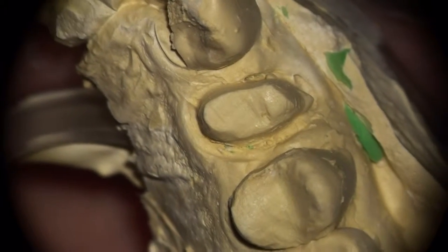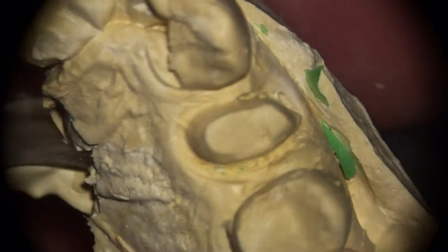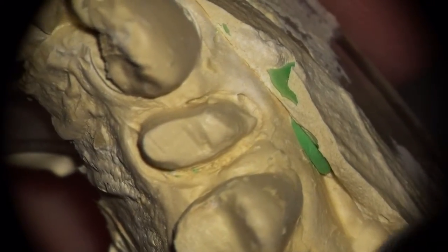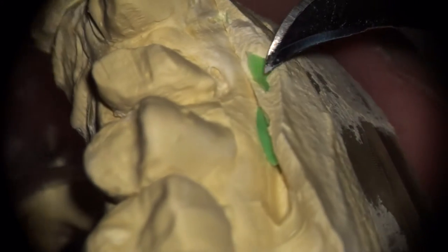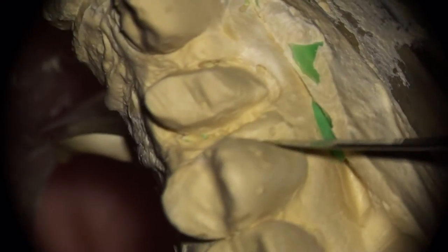So we look at this one, we see immediately, this one's going to be a little trickier. Not quite as clean as some of the other models that we've seen. Looks like there's a drag over here on the buccal aspect of that. Little bicuspid there. So I'm assuming that's a drag at this point. I'll look at it under higher magnification. We could see if the diamond marks are visible on that. Probably not.